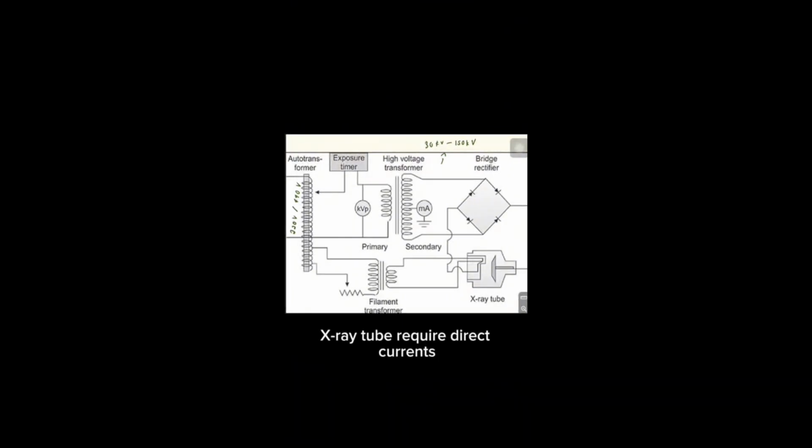The X-ray tube requires direct current to ensure a consistent flow of electrons. The rectifiers will convert the alternating current from the transformer into direct current. The steady DC power prevents electrons from reversing direction and ensures smooth X-ray production.